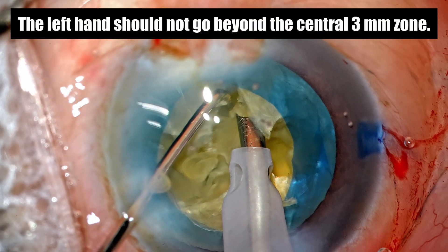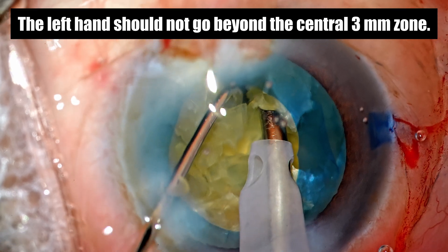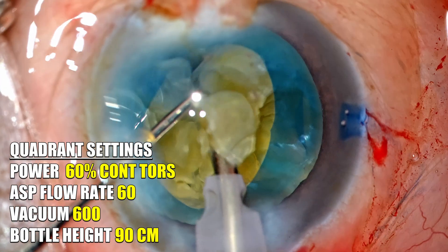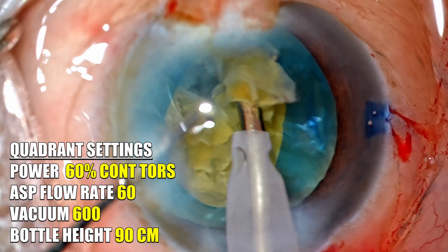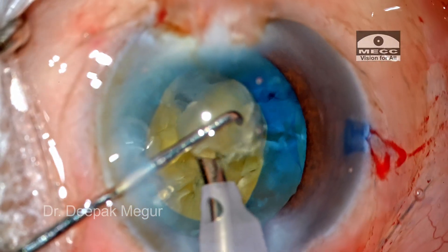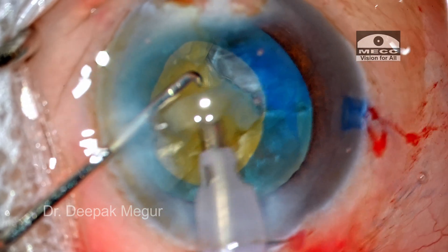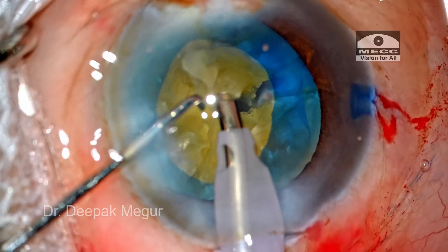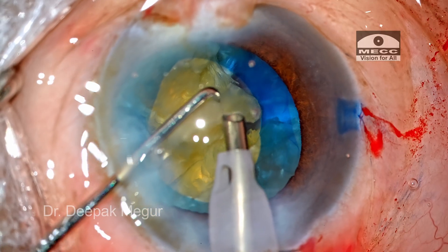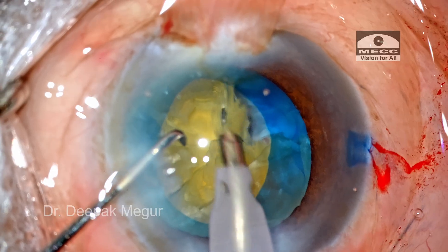I would like to remind myself that my left hand — the non-dominant hand — should not go beyond the 3mm radius from the center. Now we have all the fragments divided and ready for consumption. The settings are changed to the quadrant removal mode. Each fragment is then pulled out of the bag and emulsified. Watch my left hand as it tries to stay on top of the fragment and ensures that the fragment does not jump out and hit the endothelium. Controlling the emulsification of these fragments is critical to ensure a clear cornea post-operatively.